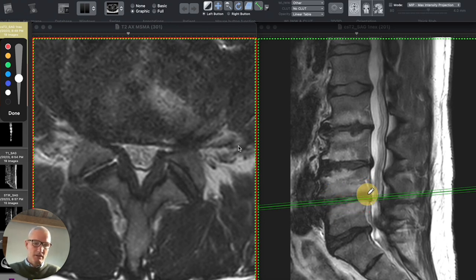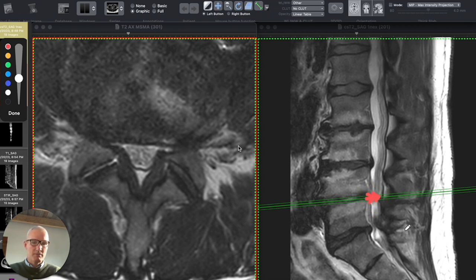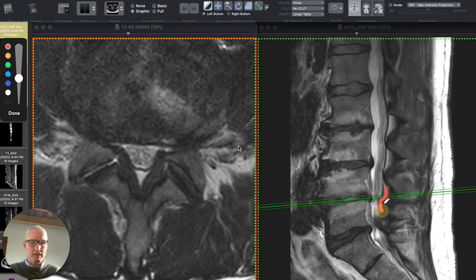In addition, there is a disc bulge pointing in the direction of the spinal canal and thickening of the facet joints and the ligaments at the back of the spine here.